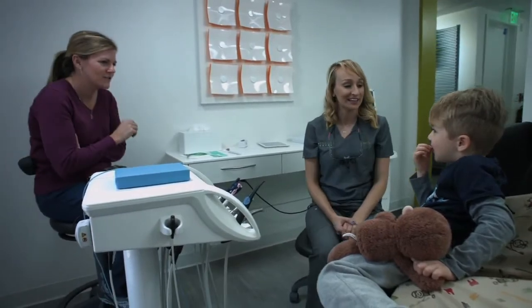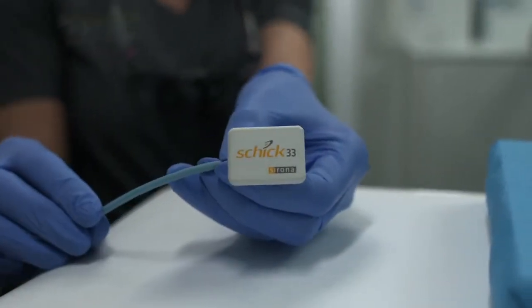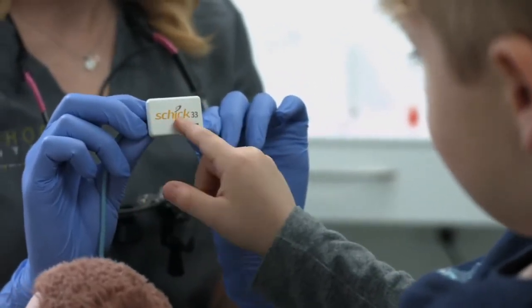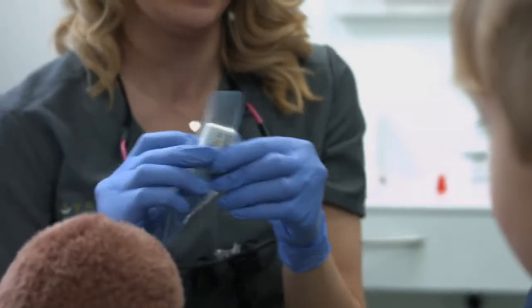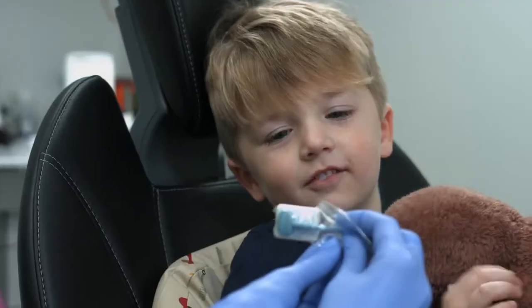When it's time for your pediatric patients to have radiographic images taken, Dentsply Sirona offers you their Schick 33 intraoral sensors. Our digital sensors are available in a size zero, offering incredible image resolution for immediate viewing and diagnosing with bite wings on your pediatric patients.